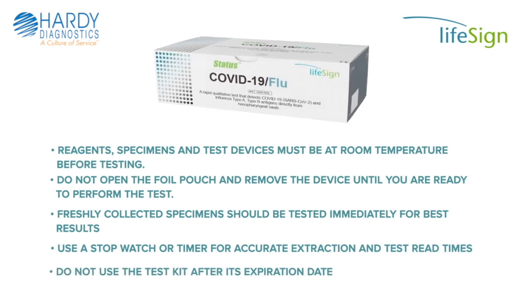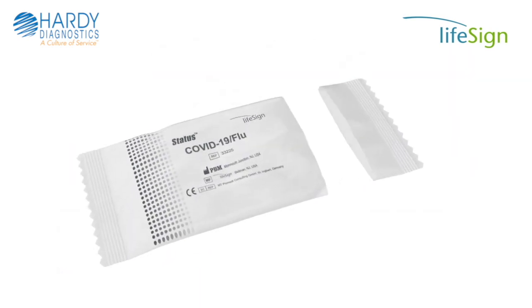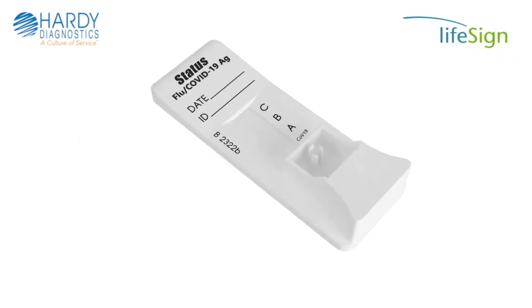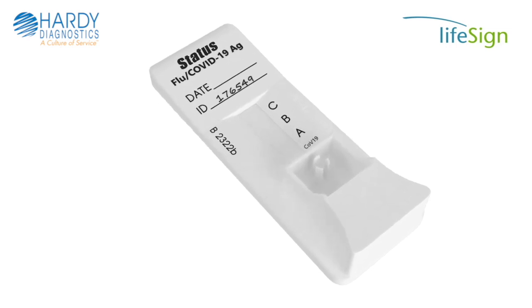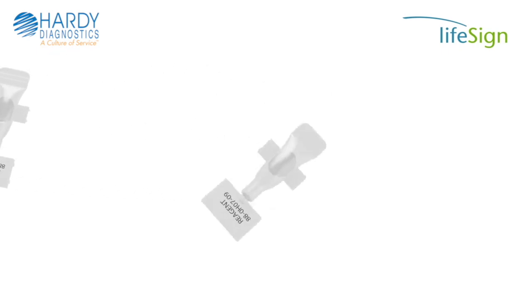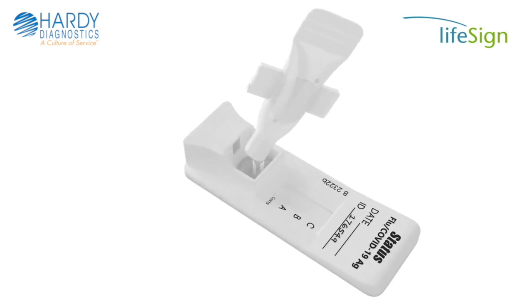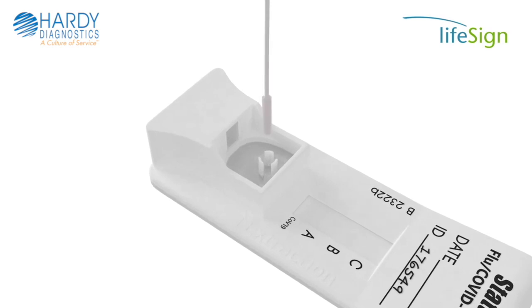Do not use the test kit after its expiration date. Once the patient specimen has been collected, open the foil pouch and remove the test device. Place it on a level surface and label the device with the patient's identification. Remove one extraction reagent capsule from the strip and tear off the tab to open. Squeeze the reagent capsule firmly to dispense all of the reagent into the sample well of the test device. Insert the patient specimen swab into the swab stand prongs in the extraction well of the device.